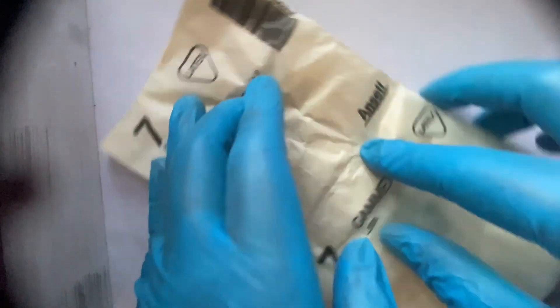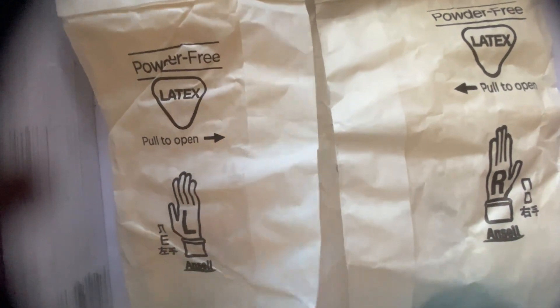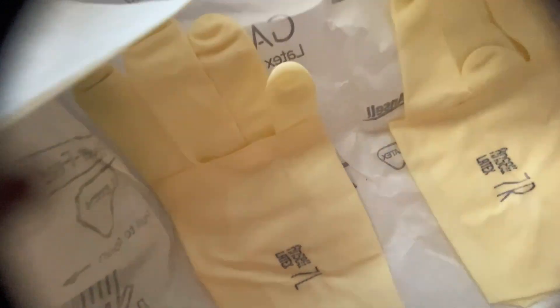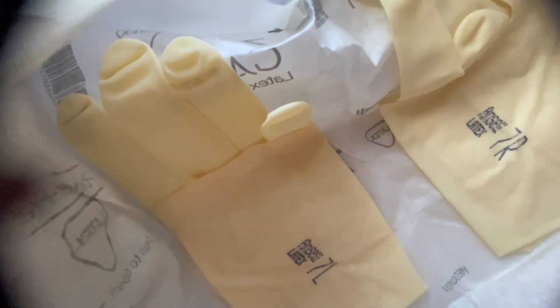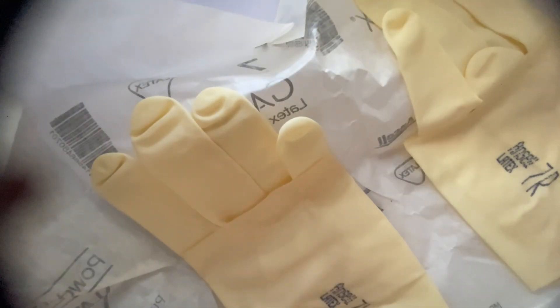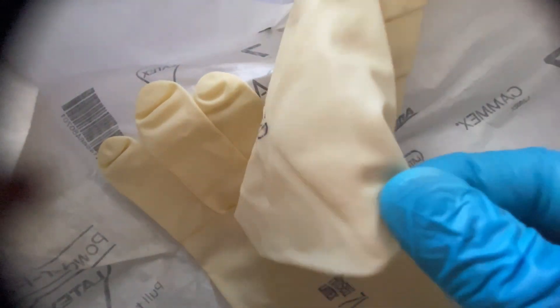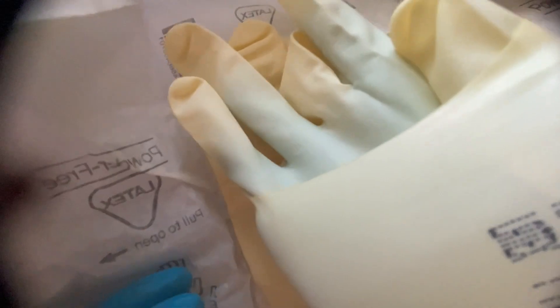This is my glove size 7. You can ask in the pharmacy and they will give you size 6, 6.5, 7, or 8 depending on your size. When you open the glove packet, do not touch the inner part of the gloves — when you touch that part it becomes non-sterile. It is very important to maintain sterility. Touch only the outer cuff area and put your fingers in like this.